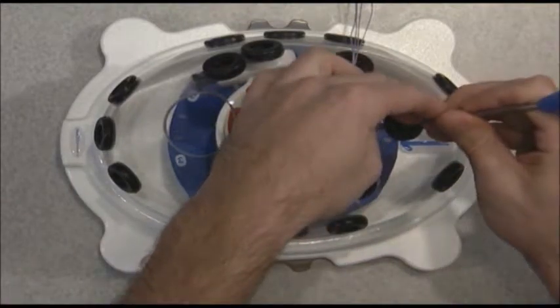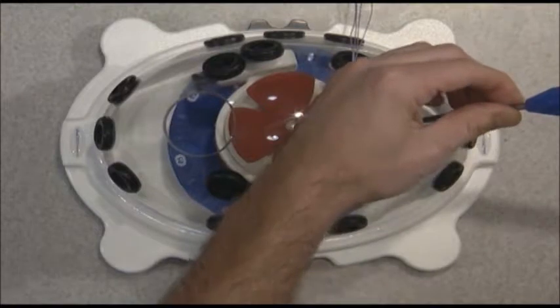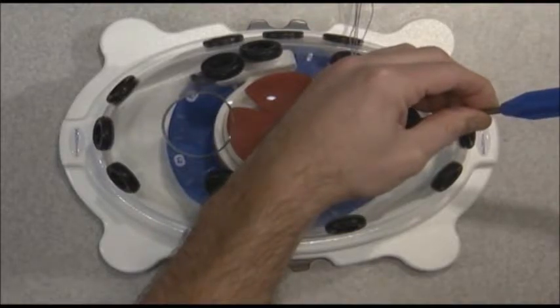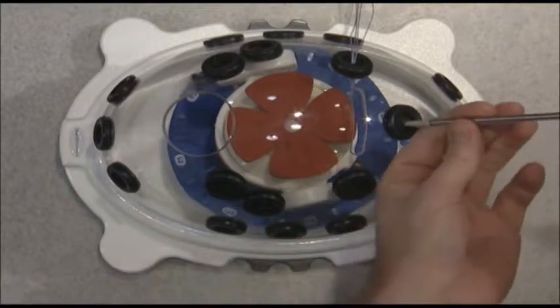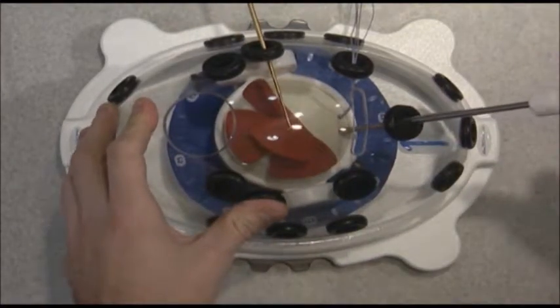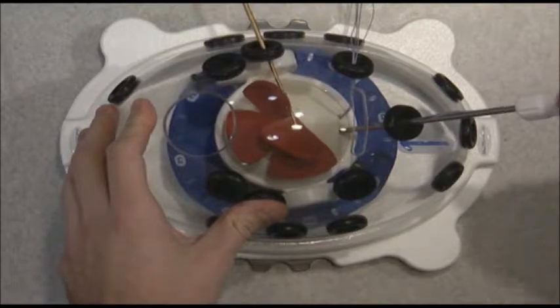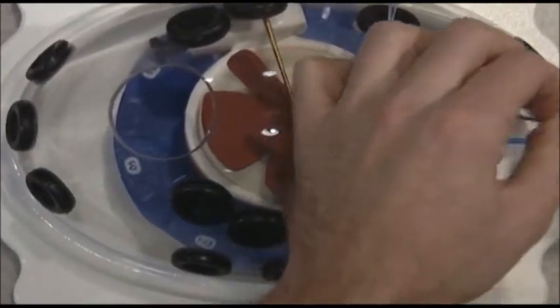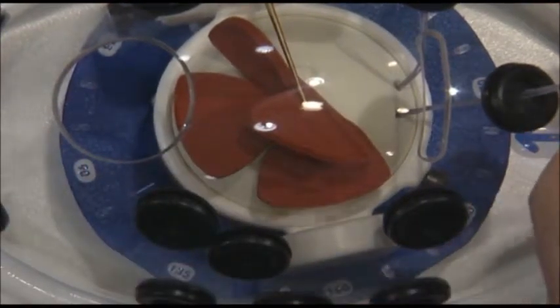We'll punch again, again concentrating on being at that optimal 45-degree angle to prevent pullout. Now we're going to place our anchor. In here we're being sure that that line is sunk just below the cortical surface, again 1 to 2 millimeters. Releasing the sutures with a gentle back and forth twisting motion.